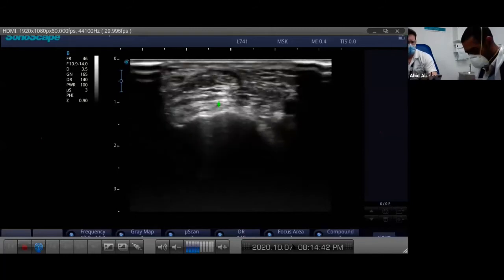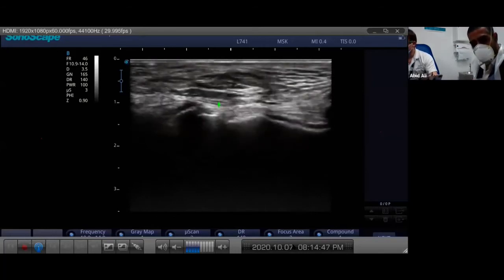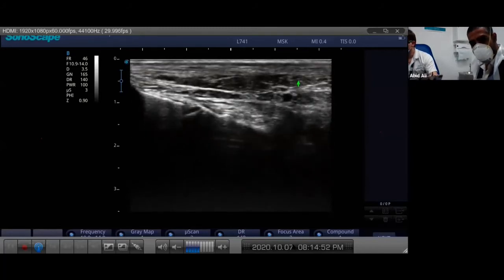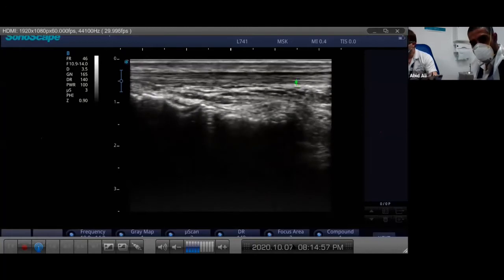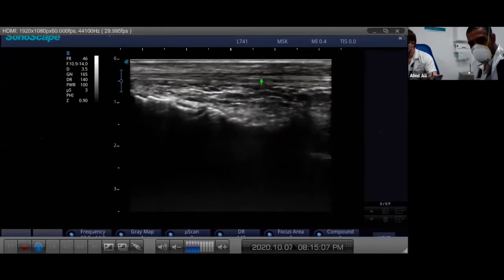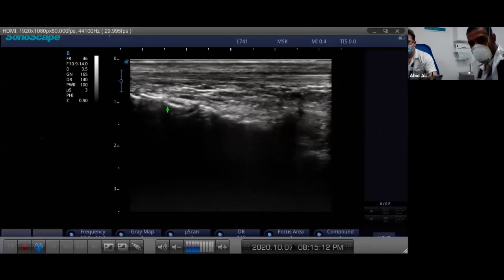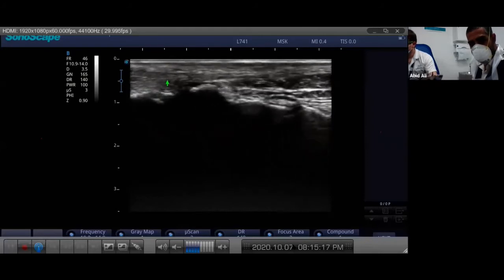We've looked at the tib ant in cross-sectional view. If you're looking for rips and tears they're usually intrasubstance, so you'll see them on the inside of the tendon. Now let's get it back in the middle and spin your probe on it and see it stretching out. You can see the whole tib ant over the midfoot from front to back, a little bit of fluid in the paratenon, and you can see the bony architecture sitting underneath.